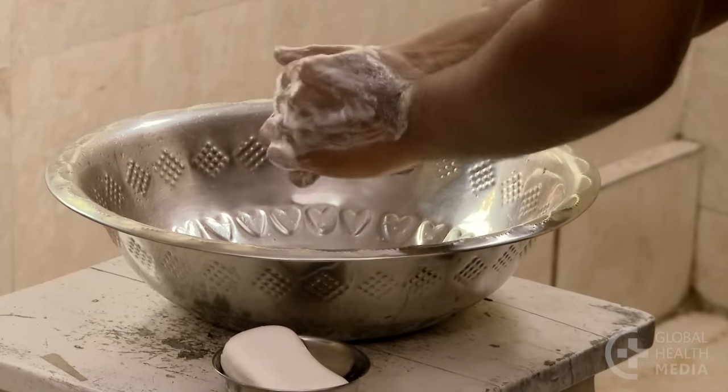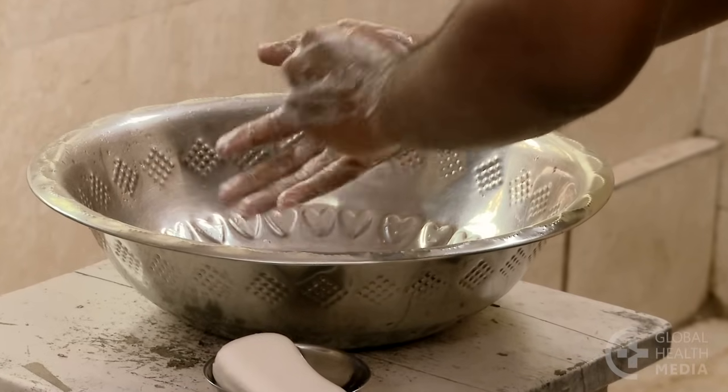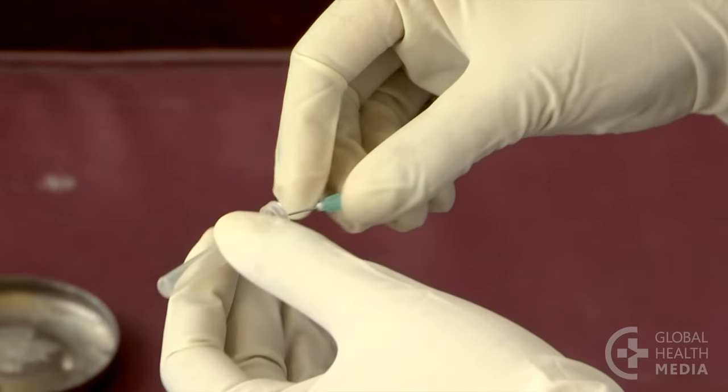Before you start, wash your hands. The easiest way to draw blood on a baby is to use a sterile needle.